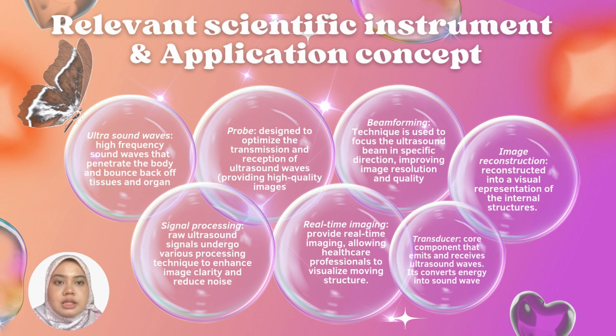Sixth, image reconstruction. Once the signals are processed, they are reconstructed into a visual representation of the internal structures. Different imaging modes such as B-mode, which is brightness mode, Doppler, and contrast-enhanced imaging provide valuable diagnostic information.